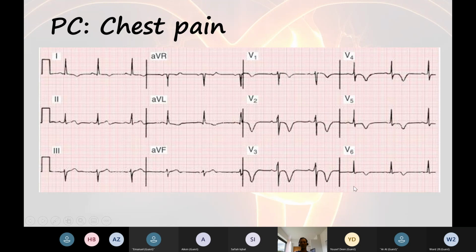had severe ischemia briefly. You can see they've not lost the R waves. But the arteries reperfuse soon enough that they haven't done any real damage. And often the ECG, when you see them, doesn't show much by way of ischemia, but then the next day the ECG looks like this, and you realize that that person is high risk and needs an urgent coronary angiogram.